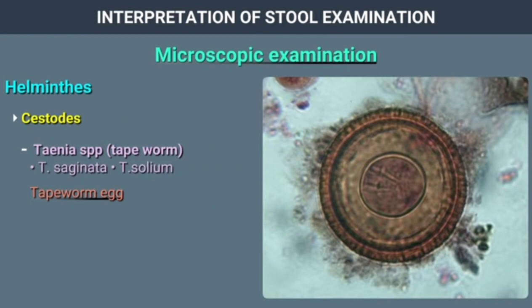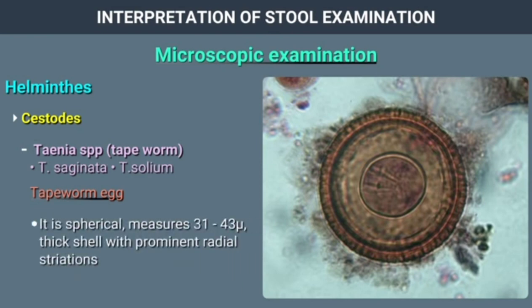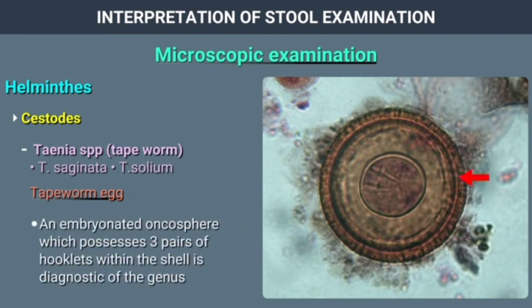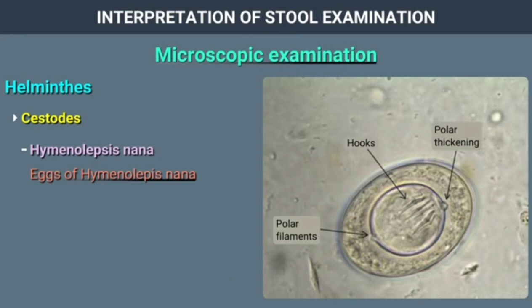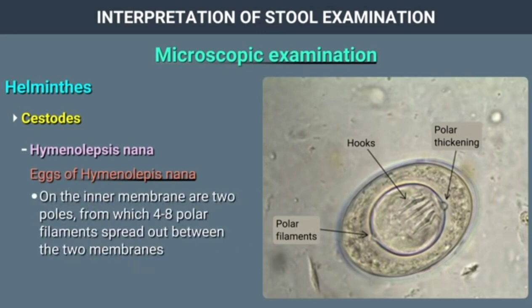Taenia species (Taenia saginata or Taenia solium): The tapeworm egg is spherical, measures 31 to 43 microns, with a thick shell with prominent radial striations. An embryonated oncosphere possessing 3 pairs of hooklets within the shell is diagnostic of the genus. H. Nana eggs are oval, measuring 30 to 50 microns. On the inner membrane are 2 poles from which 4 to 8 polar filaments spread out between the 2 membranes. The oncosphere has 6 hooks.